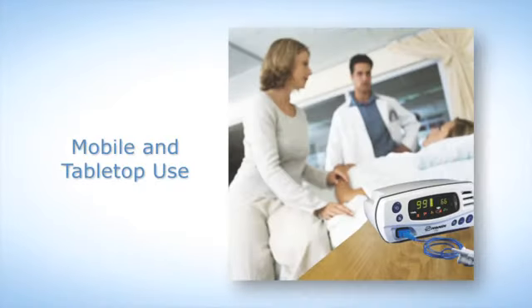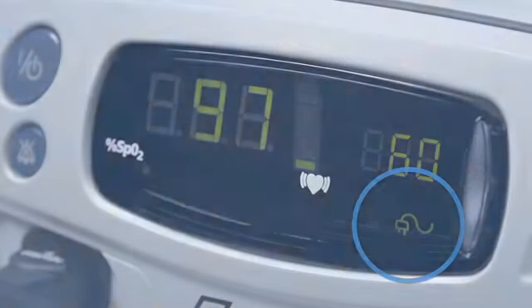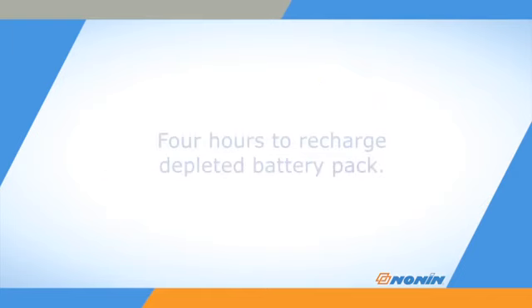This 7500 oximeter is suitable for both mobile and non-mobile tabletop uses. Both can be powered by 100 to 240 volt AC wall power. You will see a plug icon on the display when the oximeter is using external power. The oximeter can also function at least 16 hours from a fully charged battery pack. The battery recharges when plugged in, whether running or in the standby mode. Recharging takes about 4 hours when the battery pack has been completely depleted.